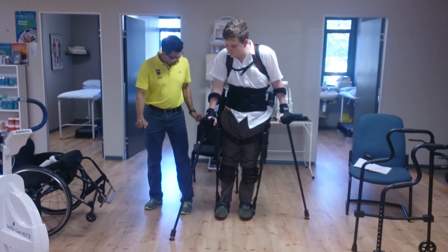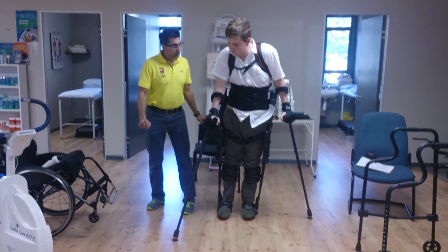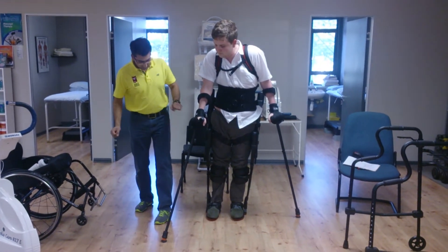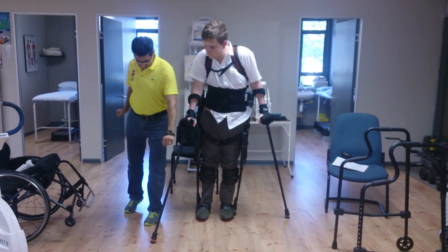The reason why is that on this crutch you can push to get you into that lateral shift, and then you can step. And on this crutch you can push to get you to the lateral step.